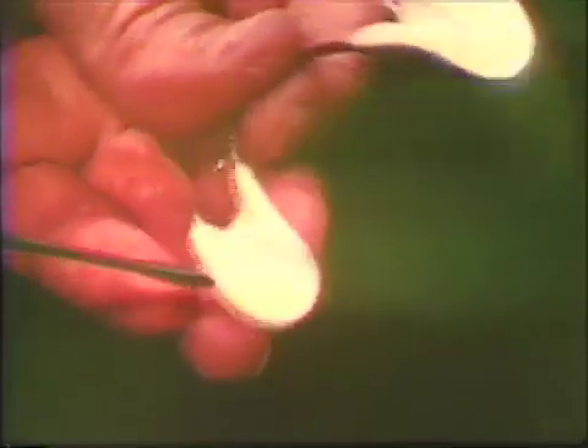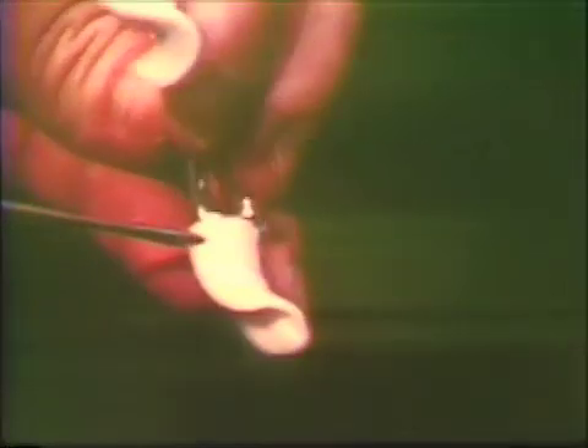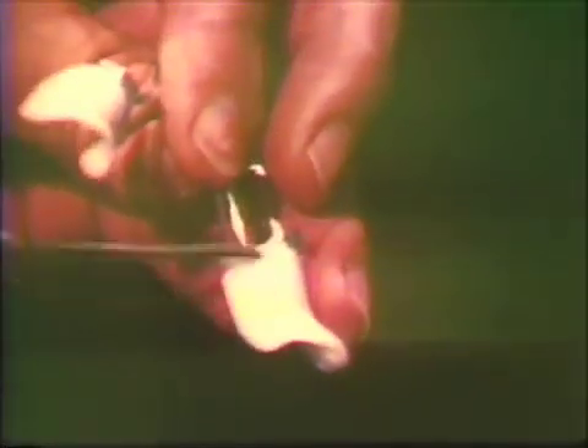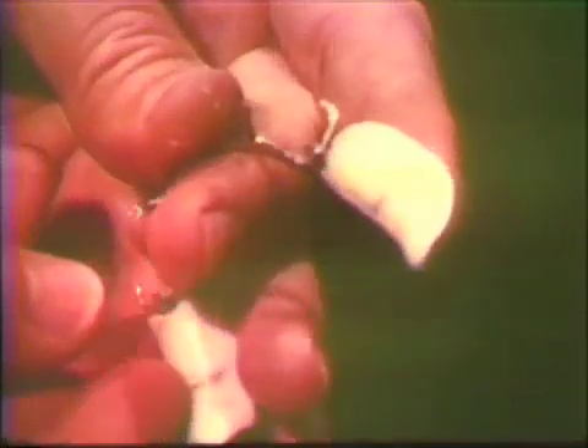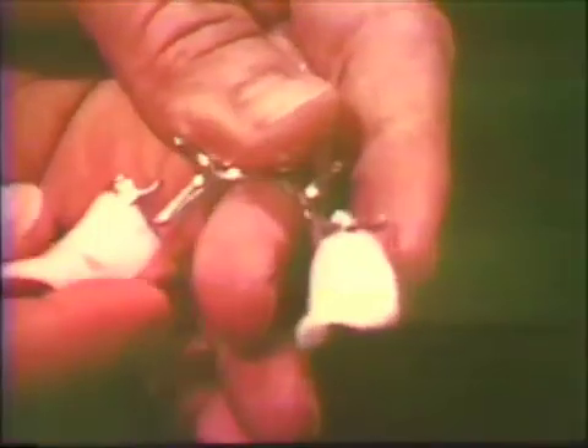The completed temporary base should exhibit a smooth tissue surface and well-rounded, non-irritating flange borders. The appliance is now ready for the next clinical procedure.